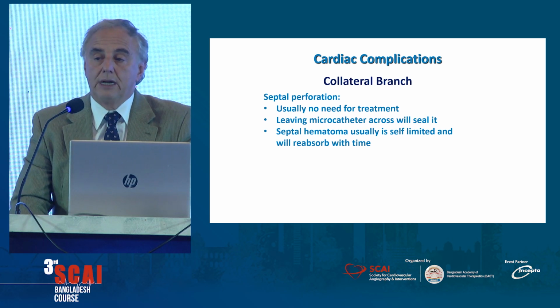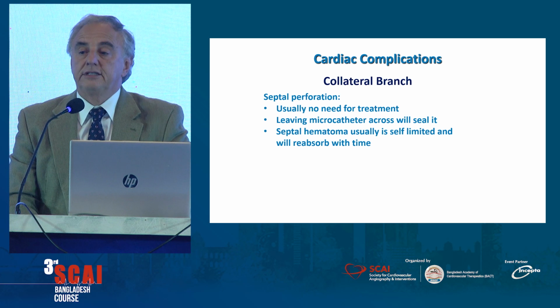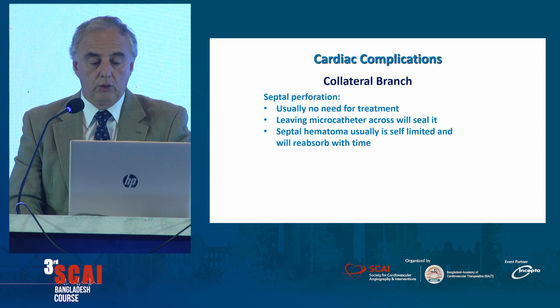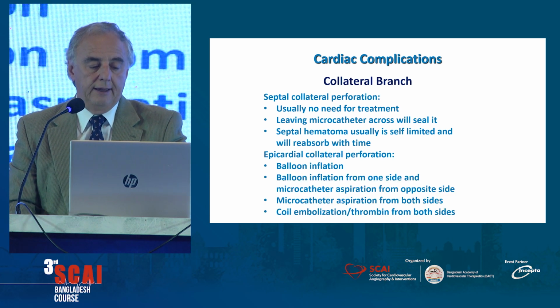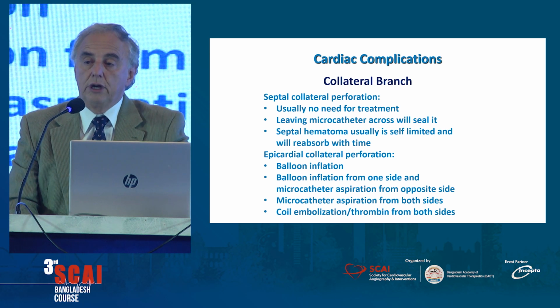The last one is collateral branch perforation, and if it is a septal, in general, the septal will not be a problem. You just leave the microcatheter there for a little bit, and it will seal the perforation. If there is a septal hematoma, usually it's not a problem. It will limit itself. If it's the epicardial, it's a little more of a challenge. There are different things that you can do.